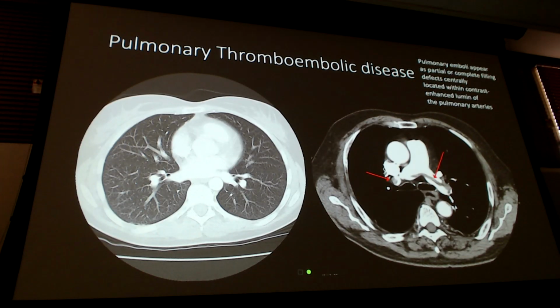Now let's look at the imaging. That's what this is, an imaging course. Now you've learned, or you will know by two weeks from now, when you're concerned about a PE, we order the CTPA, or the CT with contrast. Either one of those is an acceptable answer, because if I put CT pulmonary angiography, it kind of gives it away. So CT with contrast is the same thing as a CTPA, right? Because I need contrast, otherwise I can't find this clot.